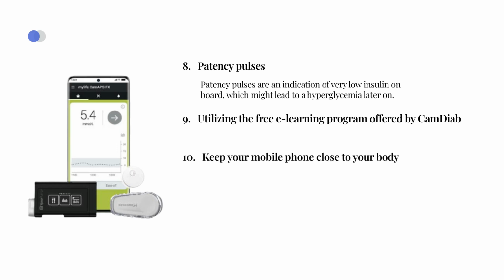10. Keeping the mobile phone, which hosts the algorithm, nearby at all times. And finally, 11. Consider having a spare mobile phone for emergencies.